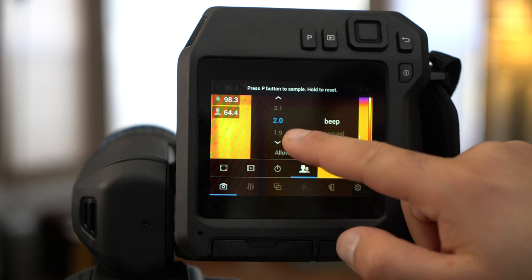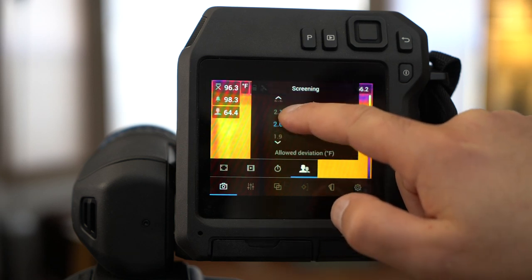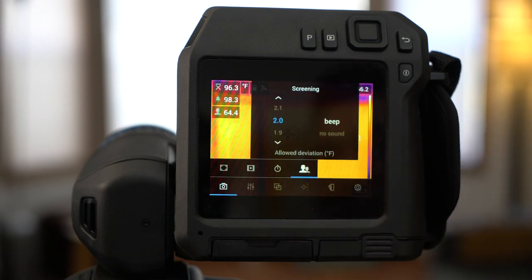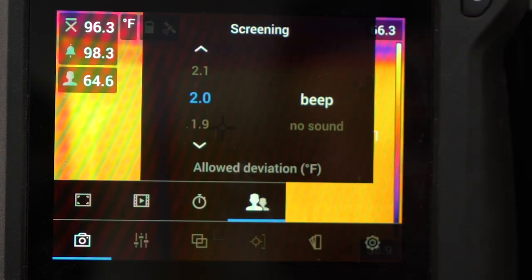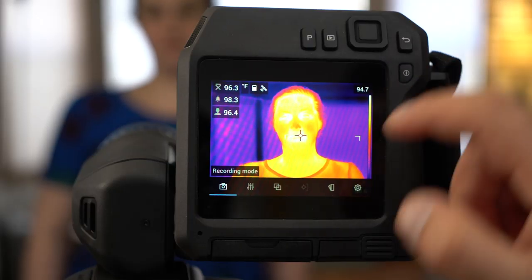Here's where you can set your alarm threshold. We're in degrees Fahrenheit, so we'll set the threshold to two degrees. You can also choose to turn the audible alarm on or off. Exit the menu.